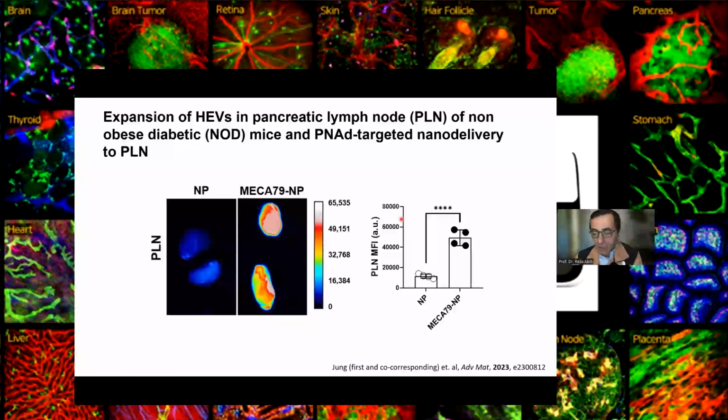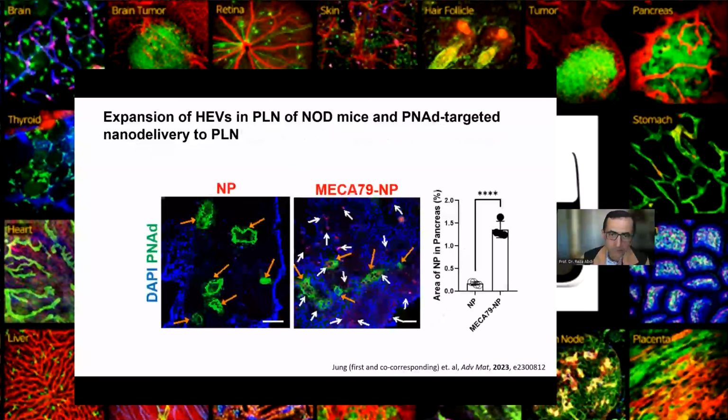The other thing I'm very much interested in is the pancreas, because we do drug delivery to the pancreas, and I was quite fascinated that you can actually image the pancreas. That would be a major breakthrough for type 1 diabetes and drug delivery to that model. This is another imaging we did of the pancreas, where we are looking for particles in the tissue. I recall you mentioned you had an image with islets as well. If you're interested in type 1 diabetes, you're more interested in the islet area, and probably you need to put insulin to it.